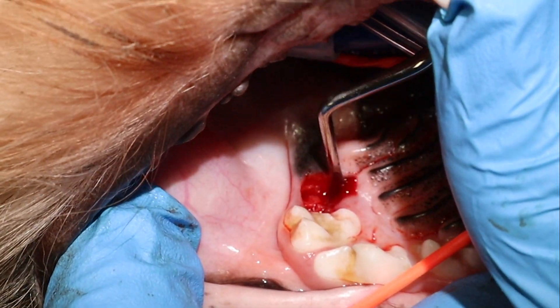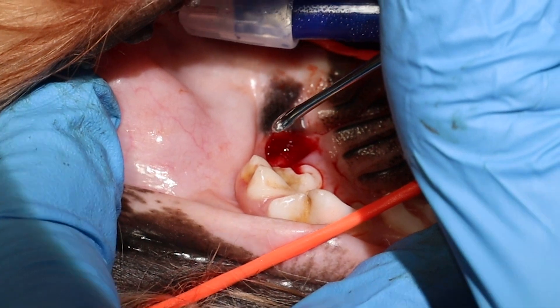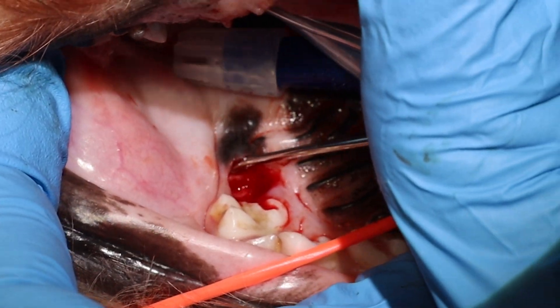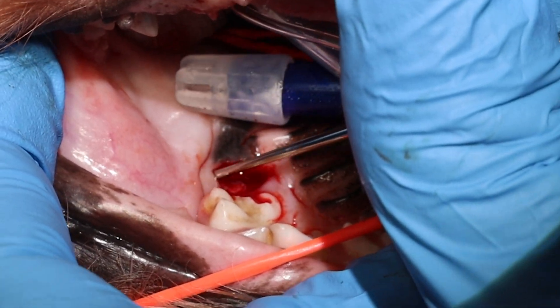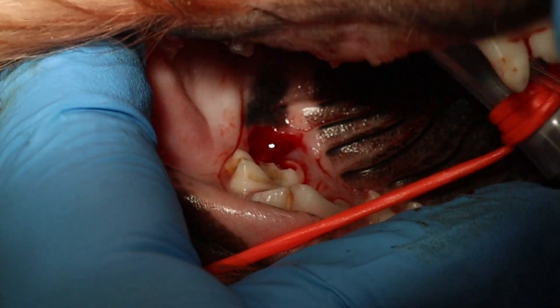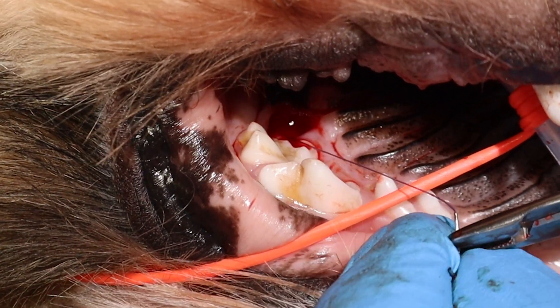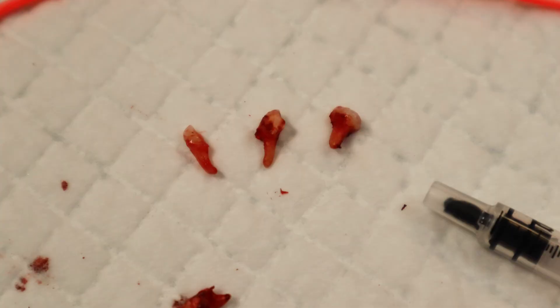After that, you go in with your curette and clean out the socket from granulation tissue — especially take care to clean the distal part of the 2O9. Here I'm doing a little bit of releasing, going under the edge of the palate and into the mucosa, just lifting up this tissue to release it a little so I can do a partial closure. You can either leave it open — that's fine — or you can do a partial closure. If this was going to be a full closure, you would need to release a lot more, and you don't really have to every time. So here are the three roots.